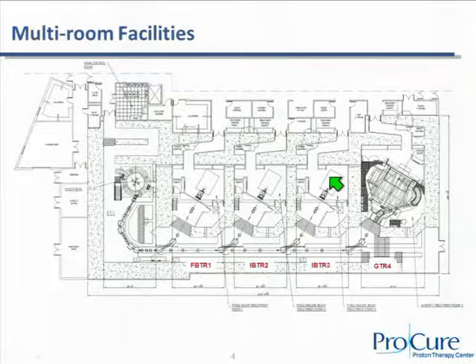Notice the amount of heavy shielding compared to X-ray clinics, and you need that to shield from neutrons that are generated when protons are hitting high Z materials, generating neutrons of all different energies that need to be shielded. So you have high density concrete everywhere, several feet of thickness, which adds to the cost of these facilities.